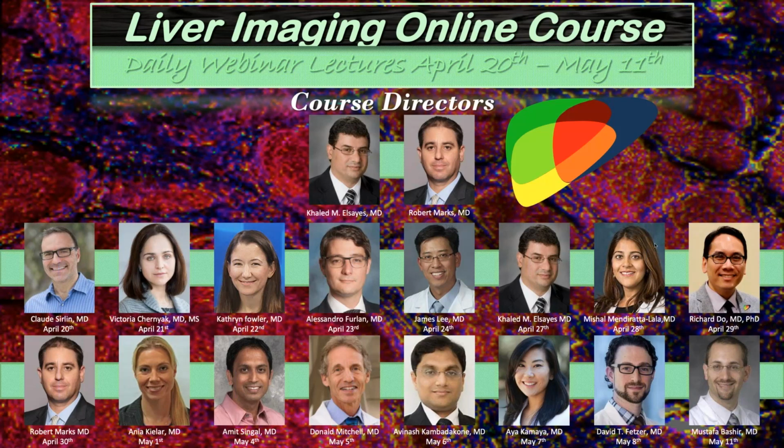Targetoid appearance is LI-RADS M. But keep in mind that I don't think we're ever going to reach perfect specificity for cholangiocarcinoma. Targetoid configuration, whether it's enhancement, diffusion, or whatnot, is usually a marker of poor internal perfusion, where the outer part of the tumor is getting better perfusion than the inner part of the tumor. And that's common of multiple tumors throughout the body.